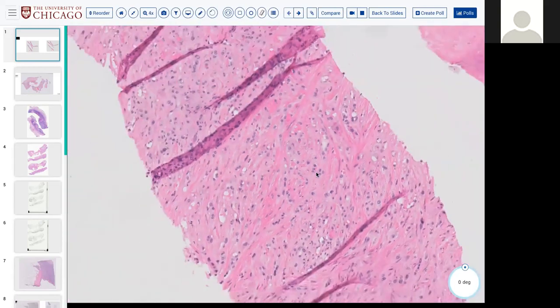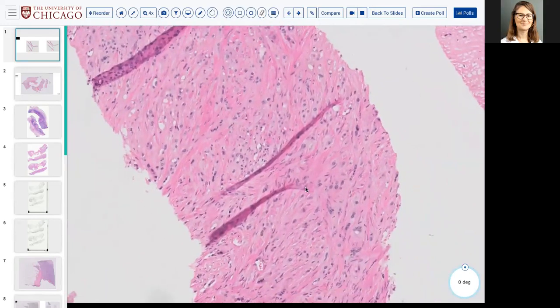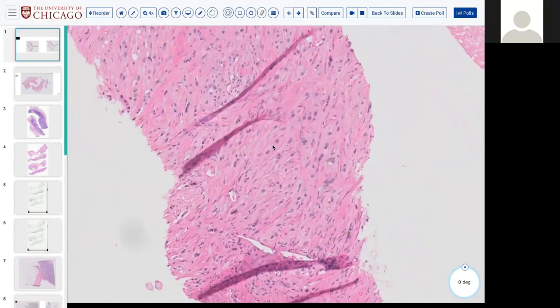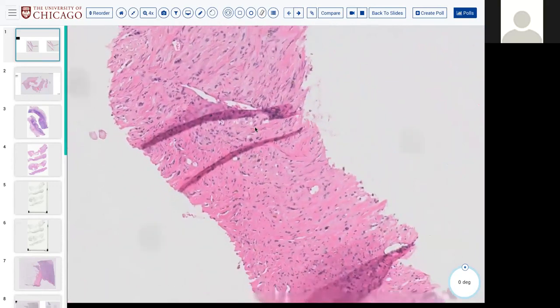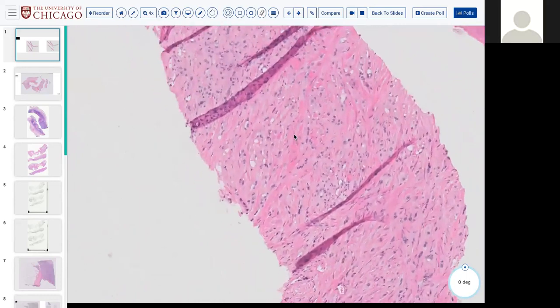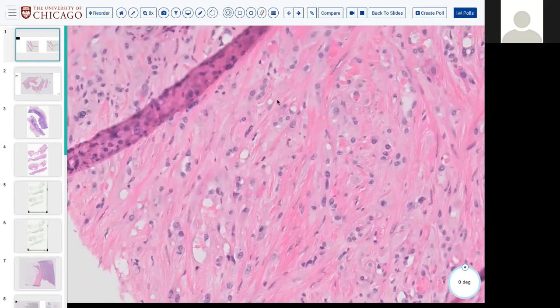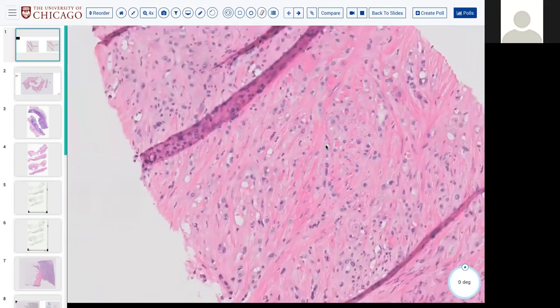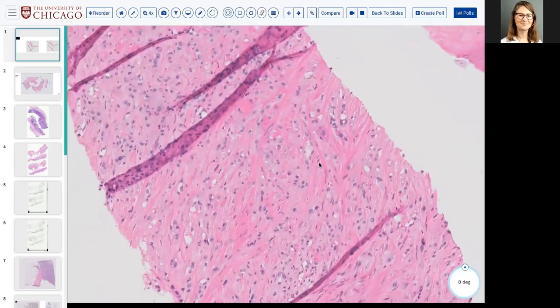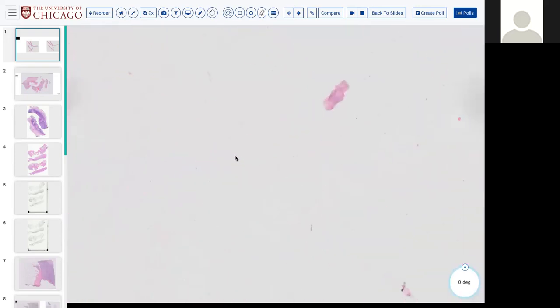Oh yeah, I guess Jasmine's saying, have you told me it was breast? Maybe this could be lobular. That is one thing. They're very epithelioid, and they're linearly oriented. Very epithelioid, and then there are areas of spaces, almost like what they call blister cells, so single nuclei or single red blood cells within these lumens. So I'm wondering if this is a hemangioendothelioma.